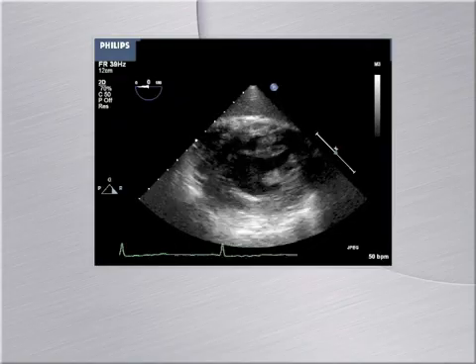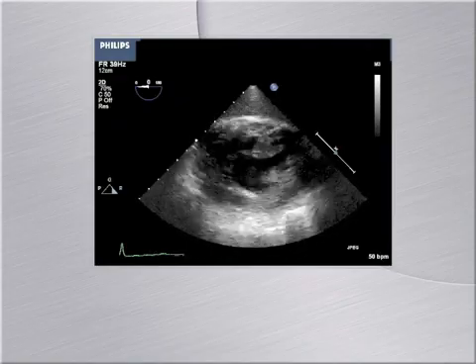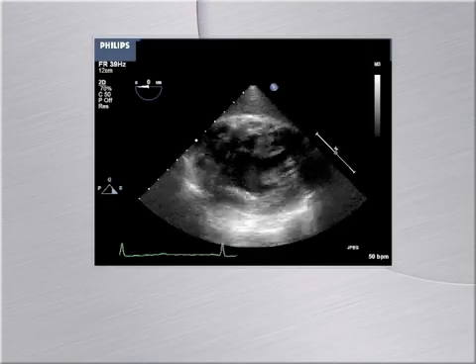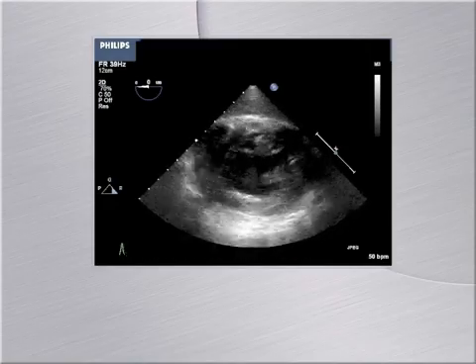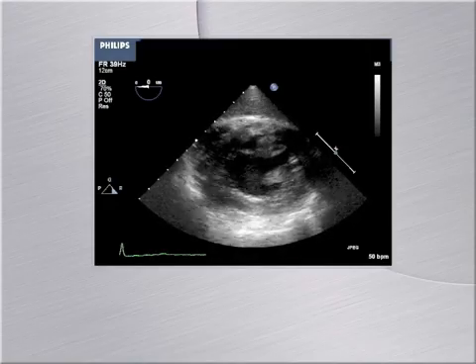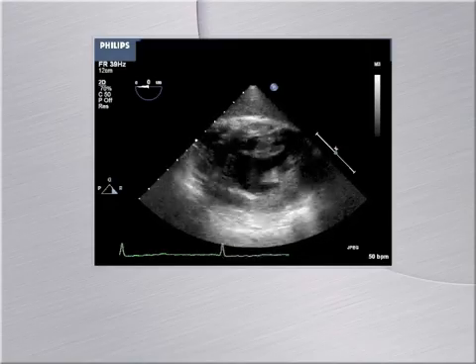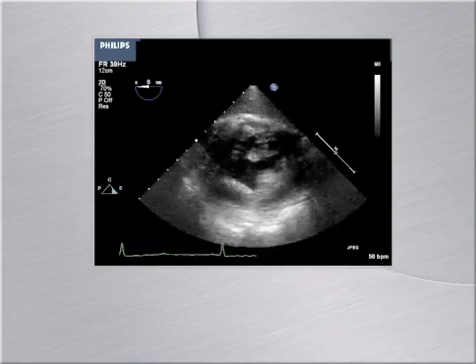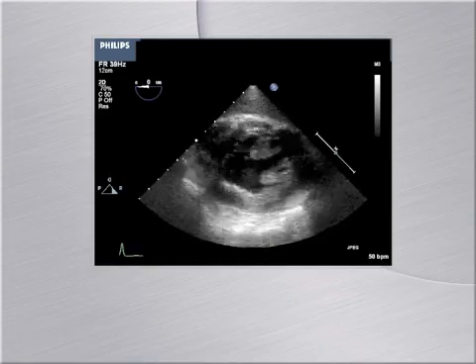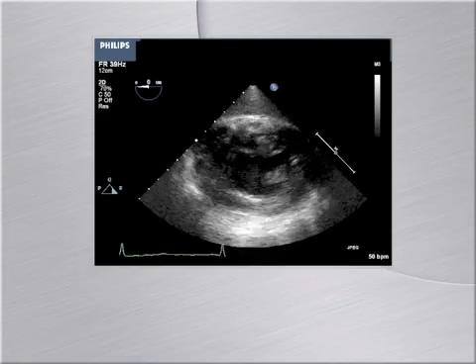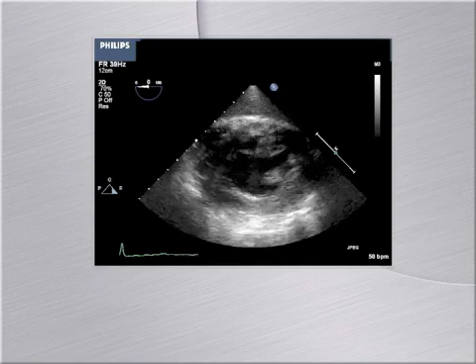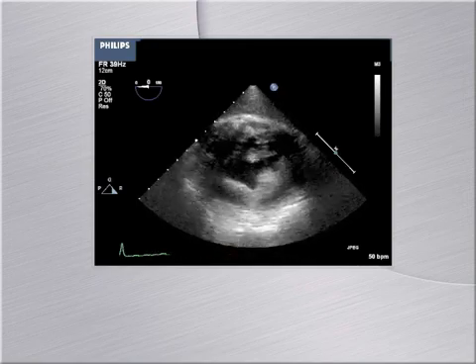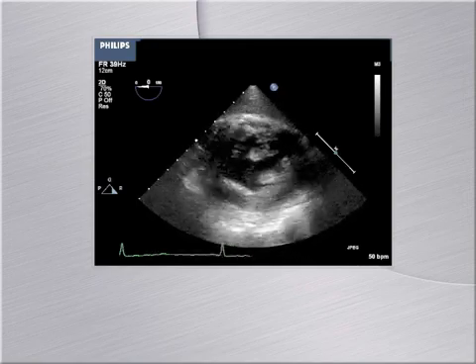The patient is bradycardic. The LV is thick but moves and contracts normally. This is another example of rate making the LV appear hypocontractile. Systematic assessment of LV function will help you avoid this pitfall.